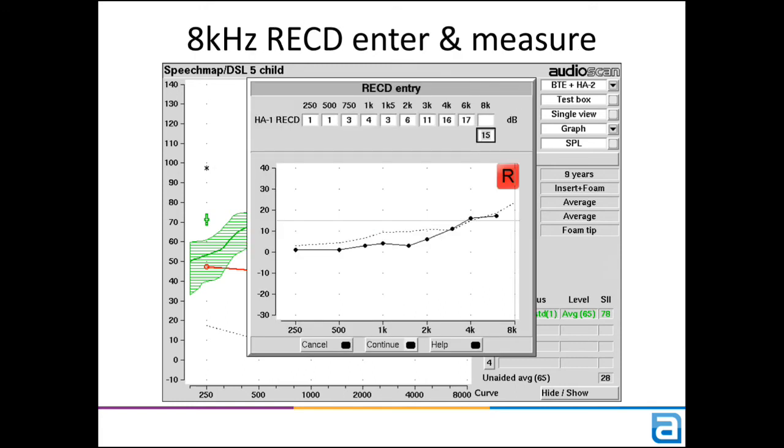Likewise, RECD on all products are measured and entered with an extra point at 8 kHz. Except, of course, the Verifit 2, which already uses wideband RECD up to 12.5 kHz.